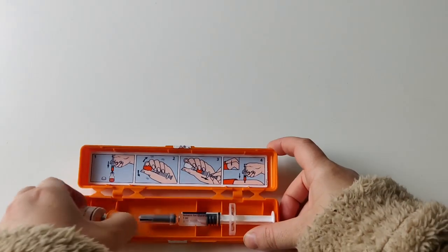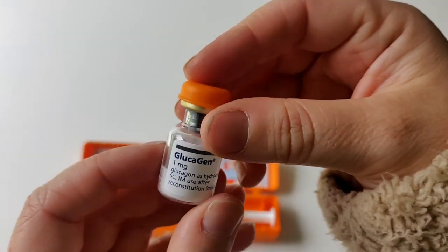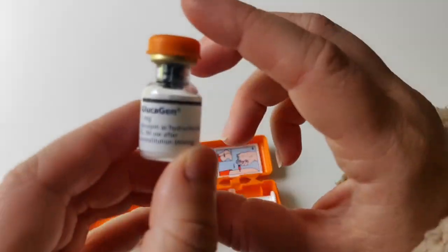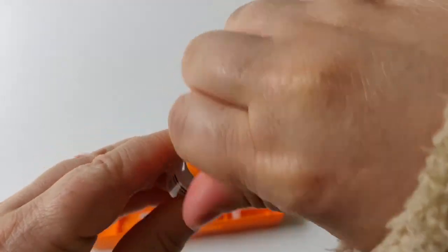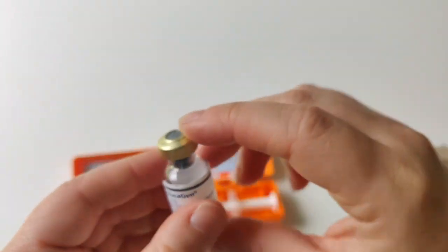First, take out the vial. You can see it just has powder inside — no liquid. This is the glucagon that needs to be reconstituted with the water from the syringe. The first step is to remove the plastic cap from the vial, and once you've done that you can see the stopper where the syringe will pierce. Get that ready.